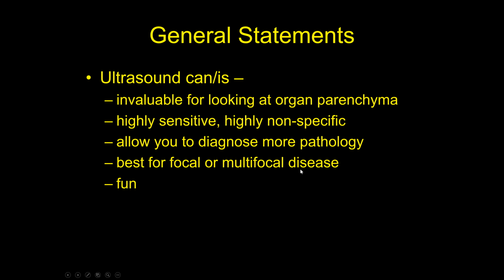So what are some general statements about what ultrasound can do for you once you learn ultrasound and start doing it in your practice? Well, unlike radiographs, ultrasound is invaluable for looking inside the abdominal organs. It's really good for looking inside the liver. Radiographs do nothing to look inside the organ. That's where ultrasound comes in. It's really good to look inside the organs.